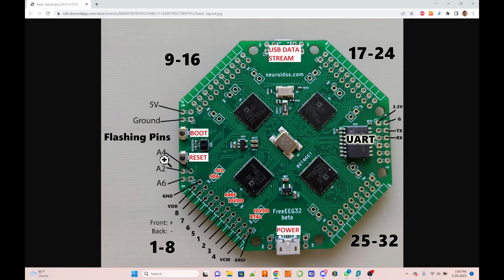On this side, A2, A4 and A6, as well as the 5 volt and the ground, are needed for flashing the board. But all the boards that were sent out are already flashed and already have firmware on them. And there is a tutorial on GitHub explaining how to do the flashing of these using these pins. But that is far outside of my knowledge base. I know how to do it step by step, but I don't know how to talk more about these things. But anyway, for the moment, no one should be needing to do that because everyone's board is already pre-flashed. So yeah, that is all the ways to connect a headset.